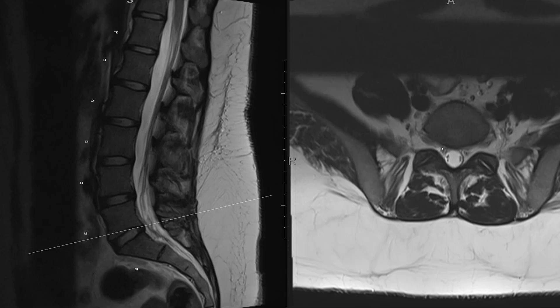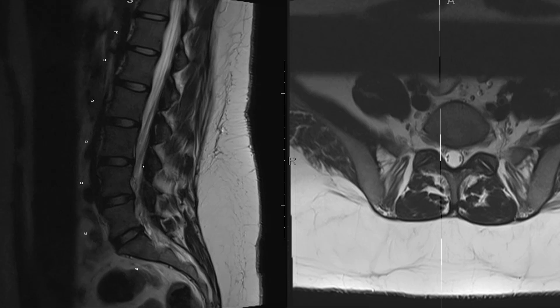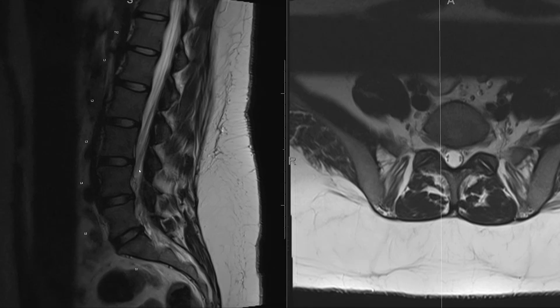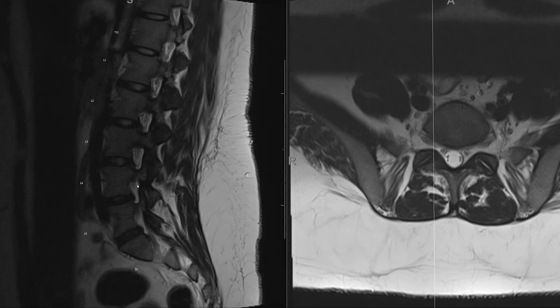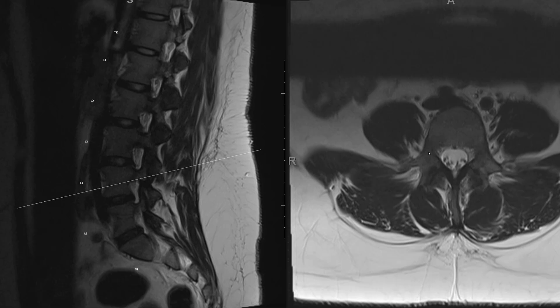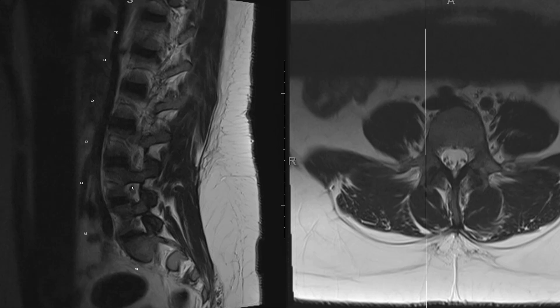The nerve roots exit out of the thecal sac into the neural foramen. If you cut it perfectly in the axial view, you can see the nerve going out. Scrolling out laterally, we can see the nerve coming down and exiting just underneath the pedicle. Here is the pedicle, and here is the nerve exiting through the neural foramen. Here's the pedicle in the axial view.